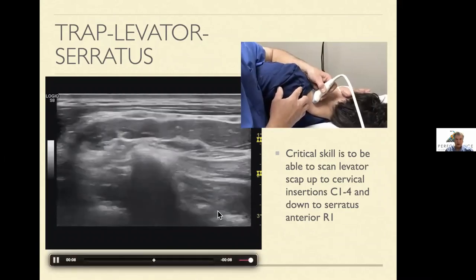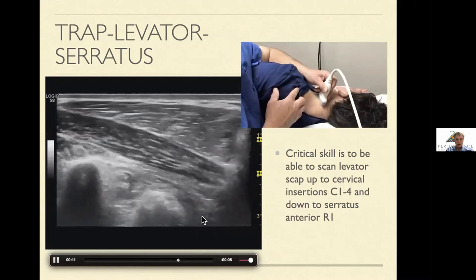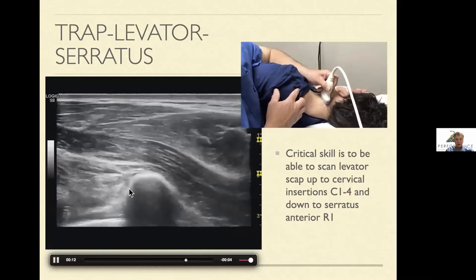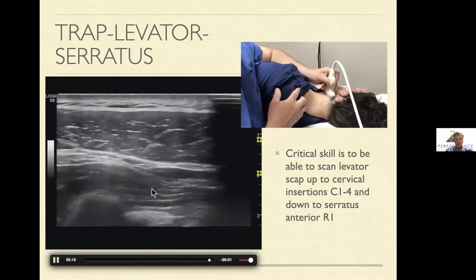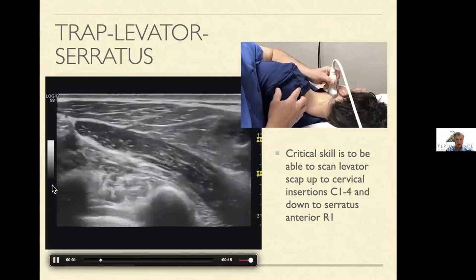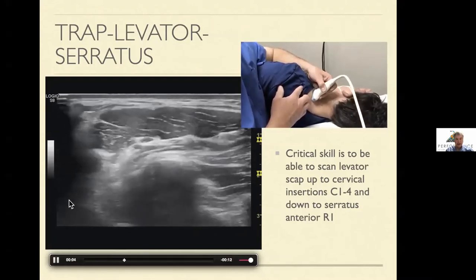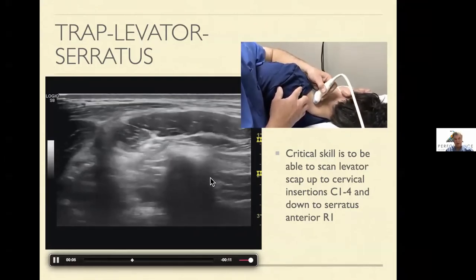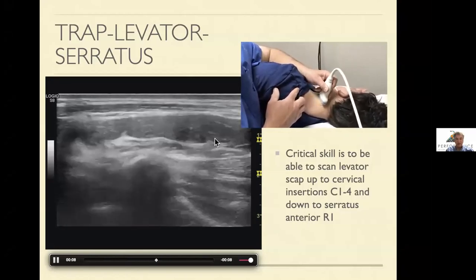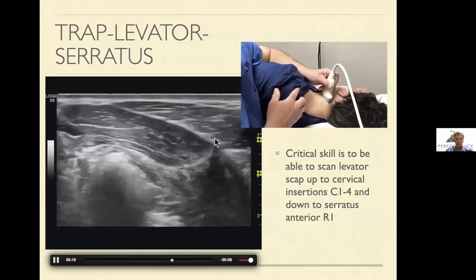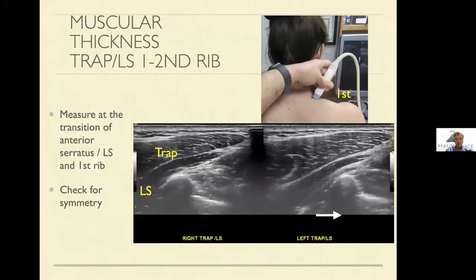Right at the end of this you'll see serratus anterior come in from this direction, underneath the levator. That's an important finding, and you need to be able to reproduce this: trap, levator scap, and the emergence of serratus anterior — because that's the critical element at the perimeter border. The scapula's relationship there is serratus anterior and levator scapula.